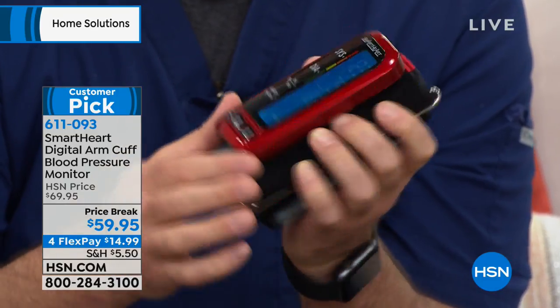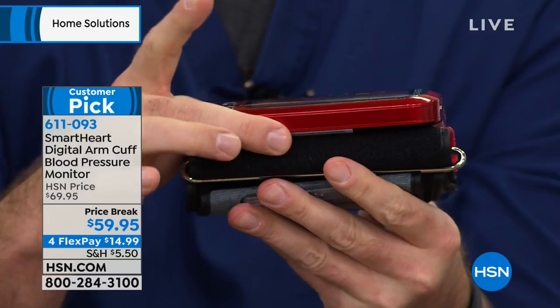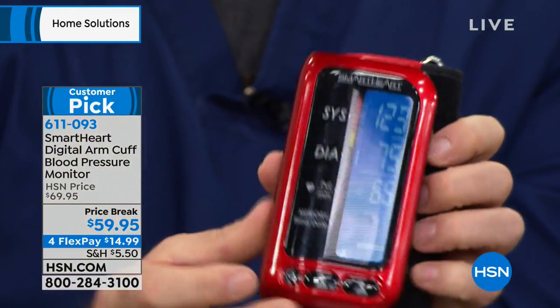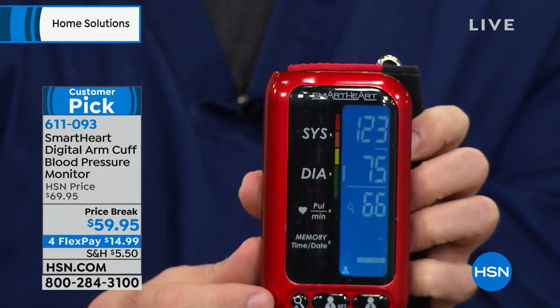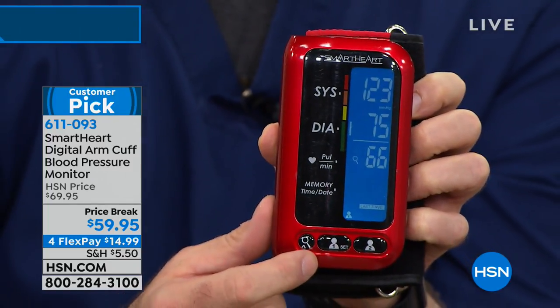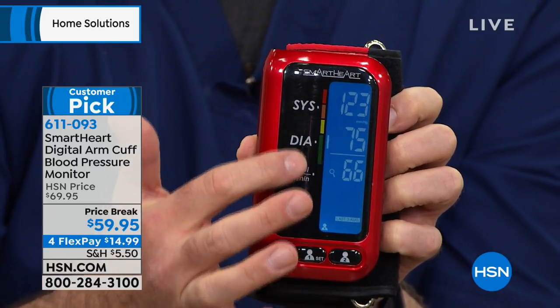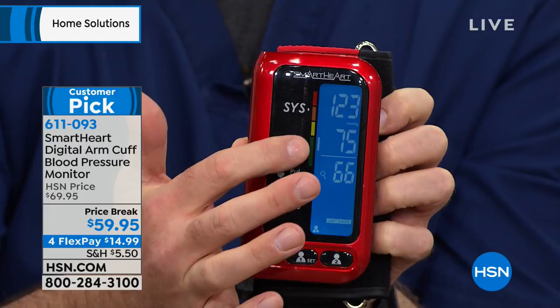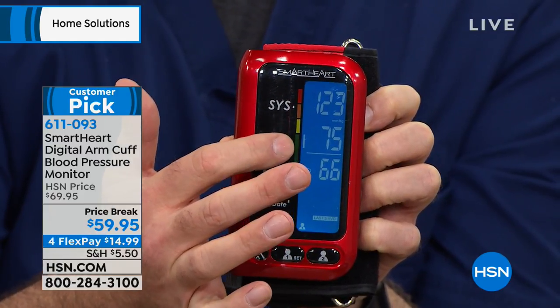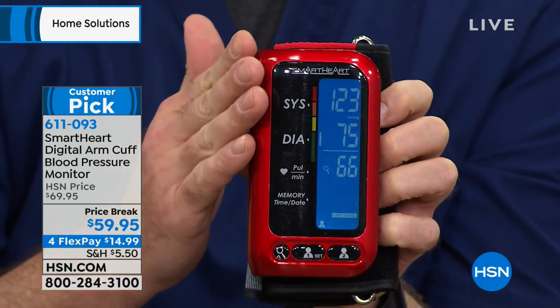I love this display. This is an arm monitor, but it's tubeless — it's attached. It comes with a five-year warranty. You're going to be able to store up to 250 readings in memory for each of two users, for a total of 500 readings in memory. It comes with that Smart Heart hypertension indicator that tells you how to interpret your reading — so 123 over 75 would be in the normal range. It's also rechargeable, so you'll never have to buy batteries.